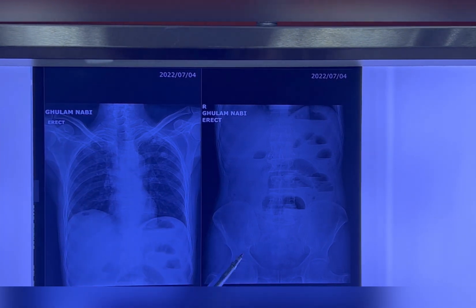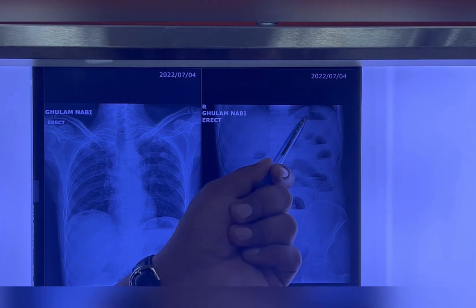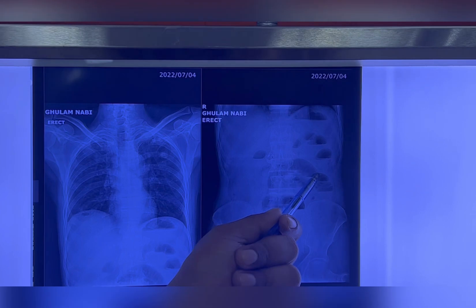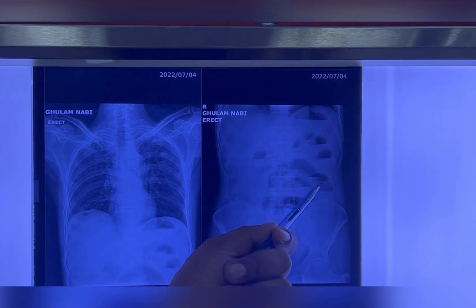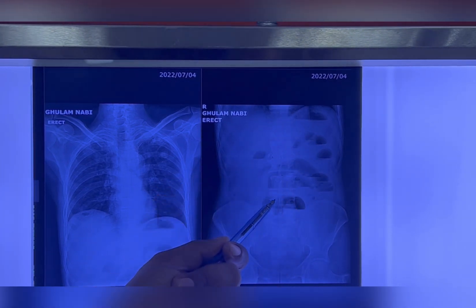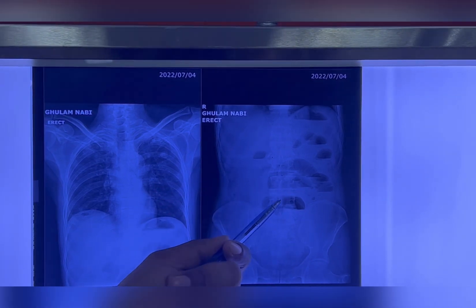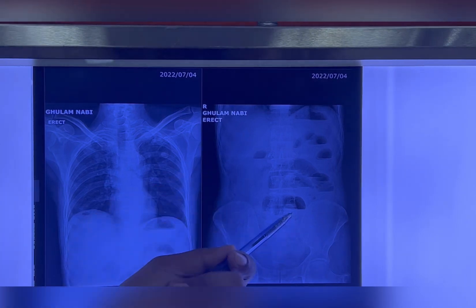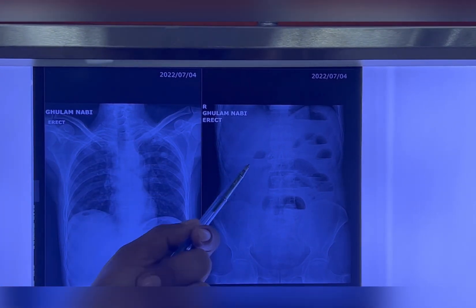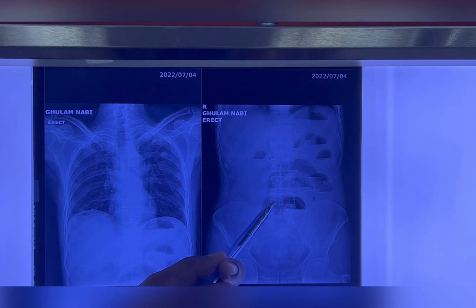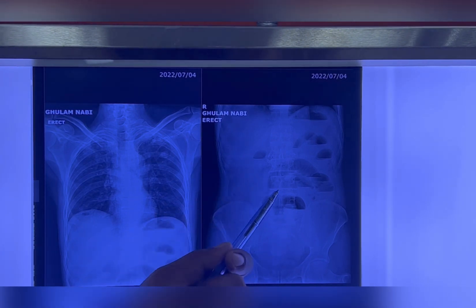But if the number of air fluid levels is increasing — like in this X-ray, there are multiple air fluid levels, up to ten — these multiple air fluid levels are very significant. They indicate that this patient is a case of obstruction. So the erect abdominal X-ray will tell you whether there is obstruction or not. But a good X-ray must also show both domes of the diaphragm and the pelvis.